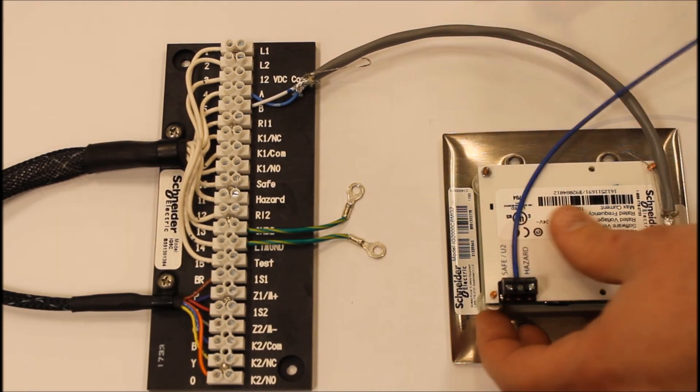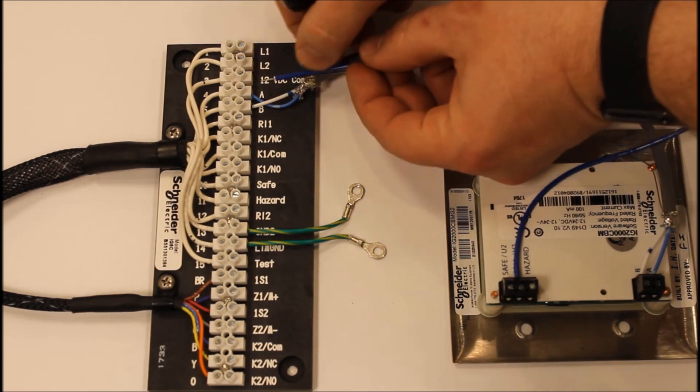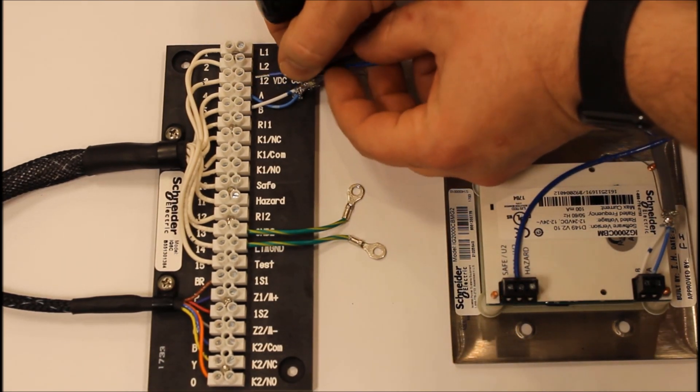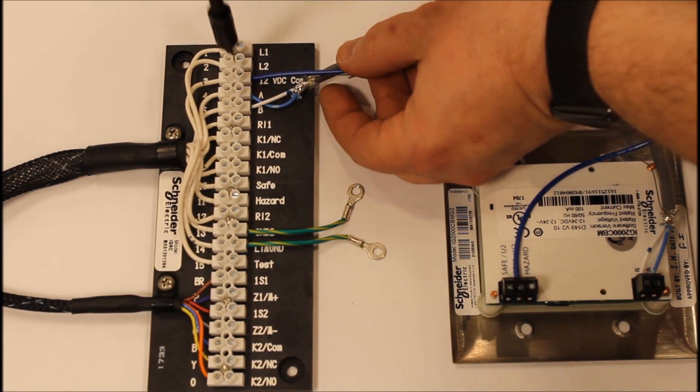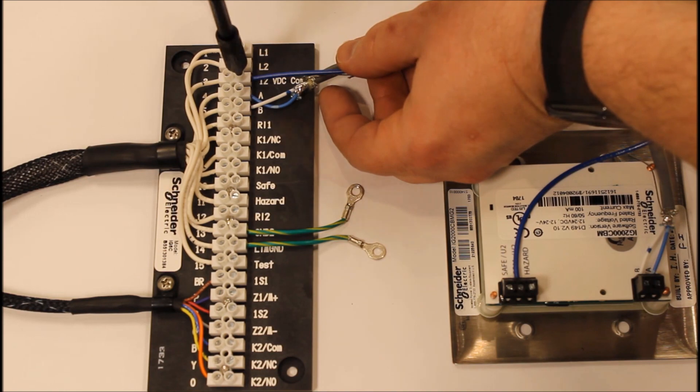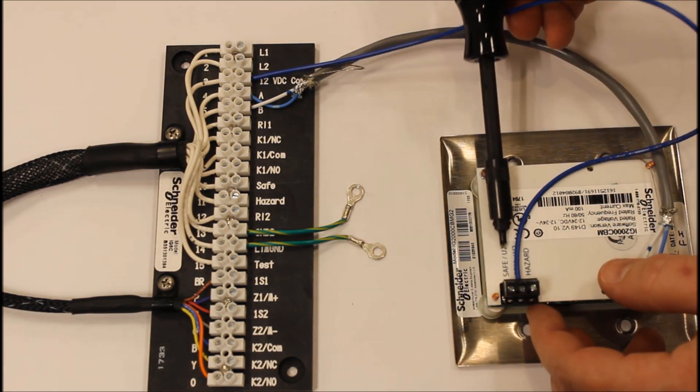That's done by connecting one wire to the common on the back of the IG-2000 and connecting to the 12 volt DC common on the connector plate.